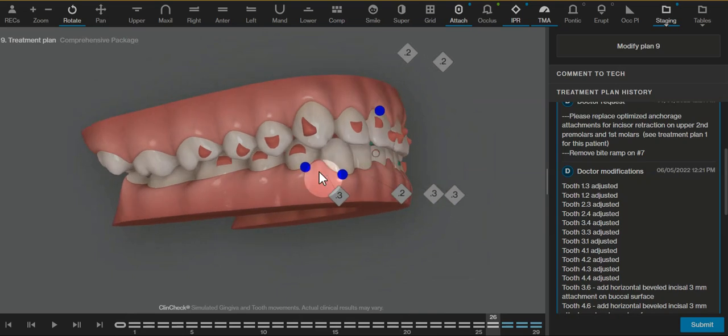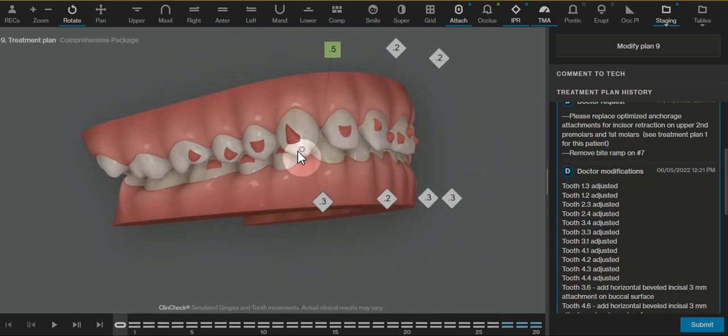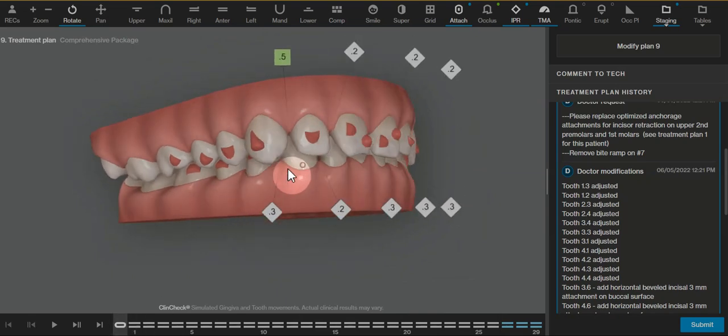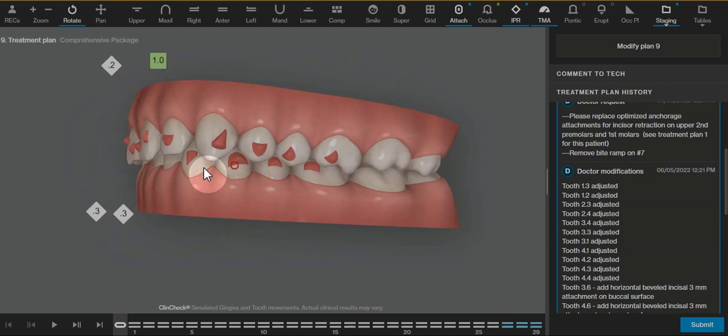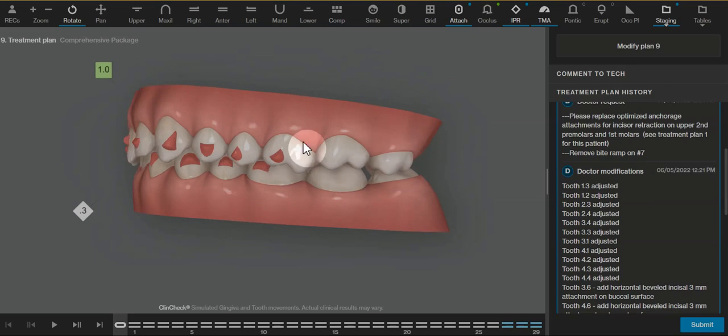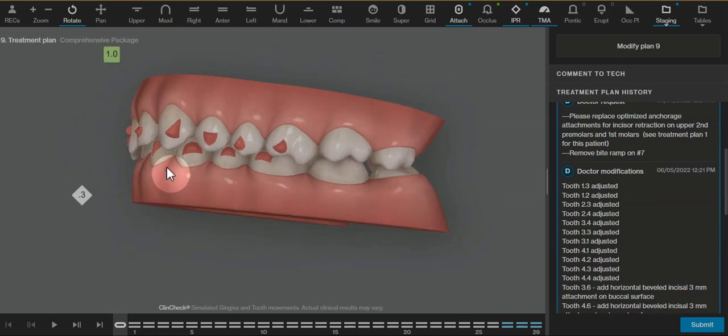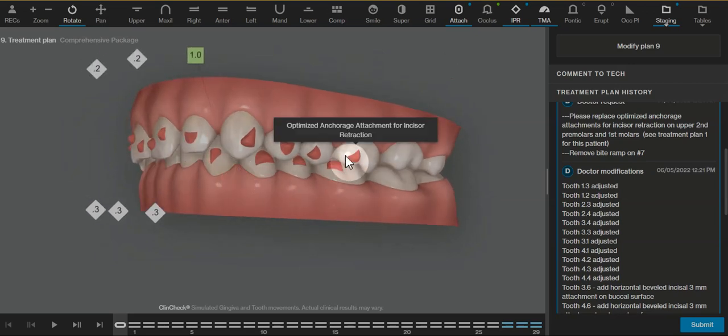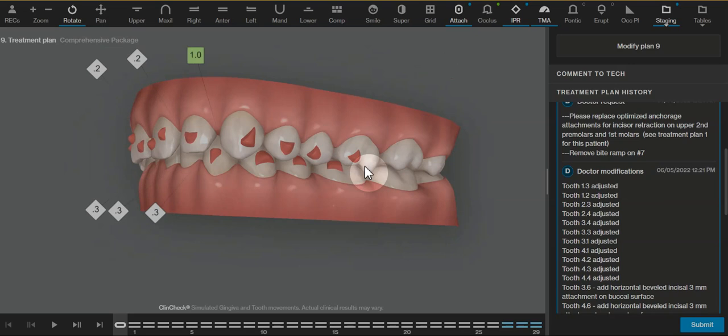So the first thing about a big spacing case is we want to make sure we have enough retention throughout the posterior, make sure that we're not moving the molars so those are anchor teeth, and then also maintain our anchorage with the optimized anchorage attachments.